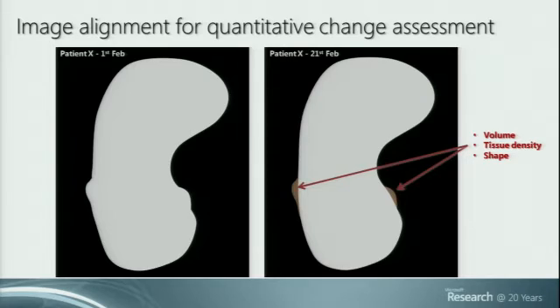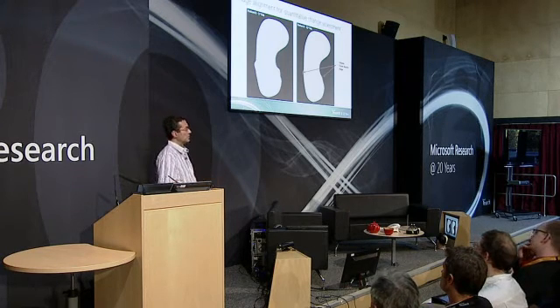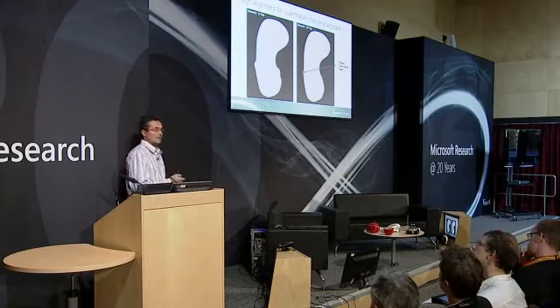In principle, applying this registration is just a simple mathematical transformation that gets applied to the image pixels. In practice, making it work really well, really robustly for all patients, for all types of medical images, and there are many, is very, very difficult. Despite about 4 decades now of research in that area, no one can say that the problem is solved.